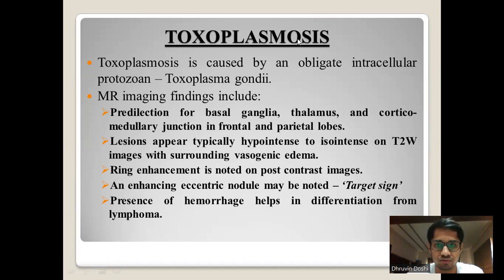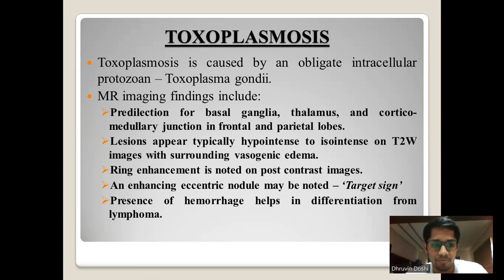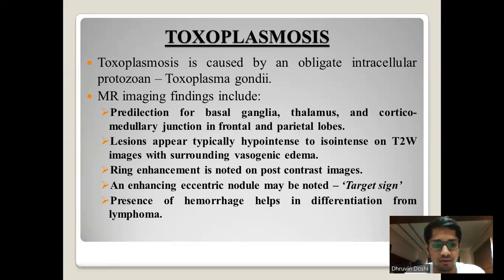The next disease is toxoplasmosis, caused by the obligate intracellular protozoa Toxoplasma gondii. On MRI, there is predilection for the basal ganglia, thalamus, and corticomedullary junction in frontal and parietal lobes. Lesions appear typically hypointense to isointense on T2-weighted images with surrounding vasogenic edema. Ring enhancement is noted on post-contrast studies, and an enhancing eccentric nodule may be seen — called the target sign. Presence of hemorrhage helps differentiate toxoplasmosis from lymphoma.